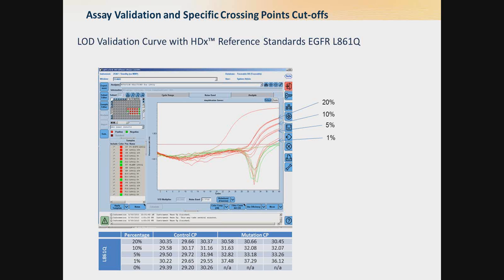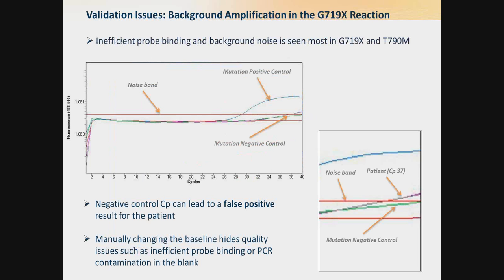Looking at their validation in greater detail, we see their dilutions for EGFR L861Q — real-time data from 20% down to 1% and the crossing point values. But there are certain variants where probe binding is not as efficient and background noise can occur. This is seen most commonly in EGFR T790M and also in G719X, which from the proficiency testing data we looked at previously is the variant that people have the most trouble with. If the negative control crossing point value is used in these cases, it can lead to a false positive diagnostic report for the patient.